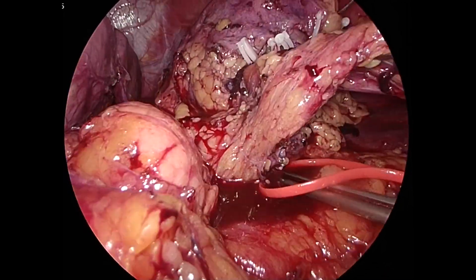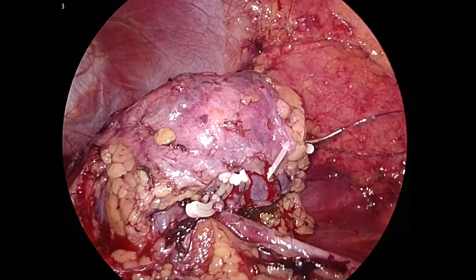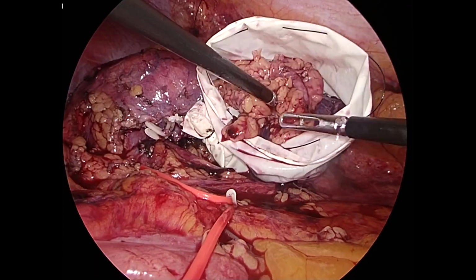At the end, the main renal artery was declamped and the fossa was checked for any bleeding. The specimen was bagged and retrieved through one of the port site incisions.